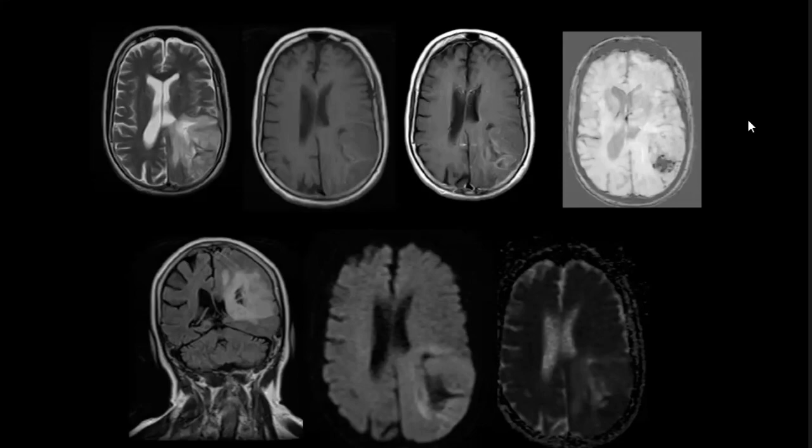Right. Okay. So now what will you call this? Do you think this is an AVM? Do you agree with the diagnosis being given to this patient? It is very much calcified, and I won't agree, ma'am. I have not seen such a calcified AVM. Okay, so what do you think that it is? What is your differential? Ma'am, my differential would be any calcified intra-axial tumor like oligodendroglioma. Okay, good.